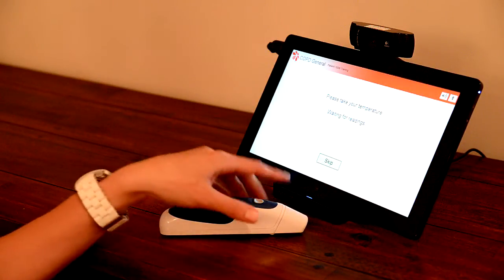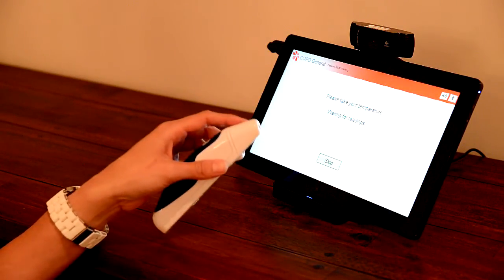When prompted to take your temperature, you can use the thermometer to take either your skin or ear temperature.